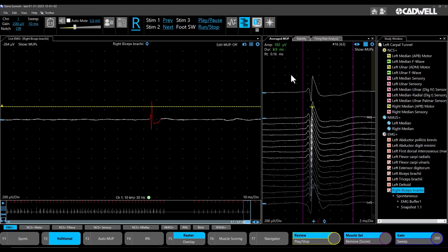During acquisition, as well as when you're paused, you can see results. So here we can see an amplitude, duration, and rise time of the live data while you're acquiring it. If the results are colored green or red, that's because there may be reference limits entered for those results, and it's showing you that the numbers are within reference limits.